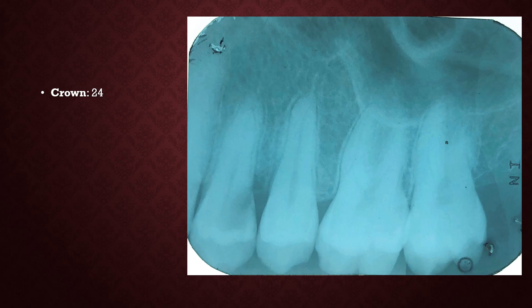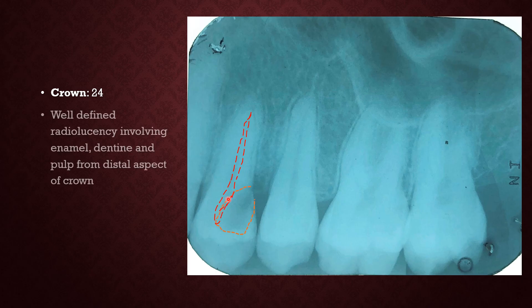We have identified that our tooth of interest here is 2-4. We see a radiolucency in the crown. This radiolucency, if you observe closely, is arising from the distal part of the crown and is extending to involve the enamel as well as the dentine. You will also see that it is actually involving the pulp of the tooth. This radiolucency most likely looks like dental caries — a well-defined radiolucency involving enamel, dentine, and the pulp.